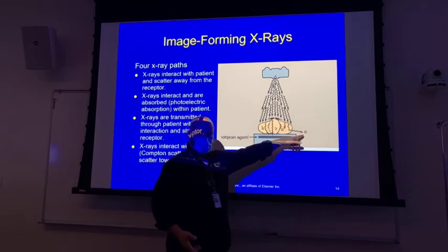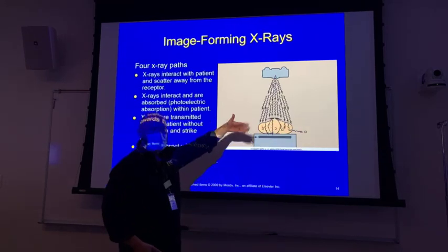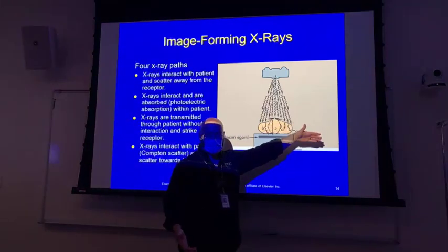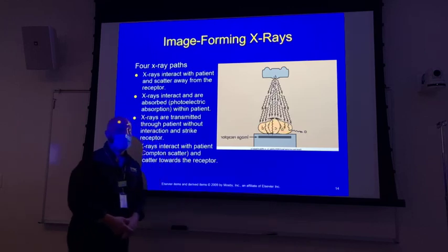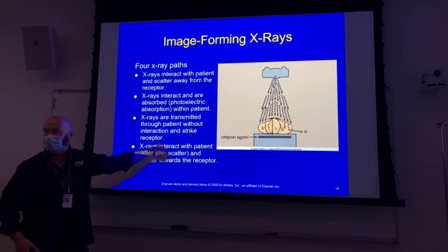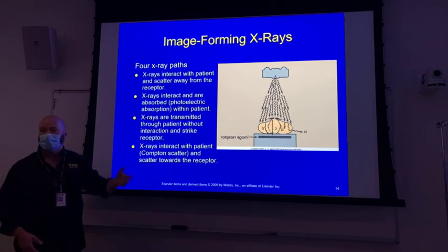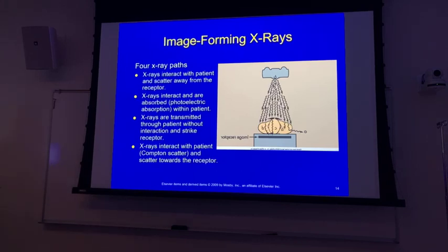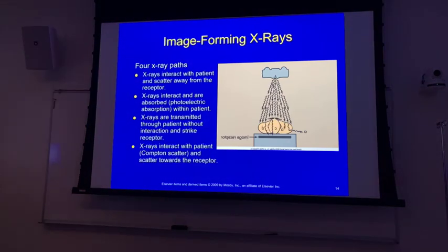Your dose is coming off of this thing, right? So when that enters your body, and it's kind of like secondhand smoke, it's going to be a lower energy, right? The patient filtered out some of that energy, but what's going to be happening inside of you? All of that, right? Including you becoming an X-ray emitter and an X-ray creator.